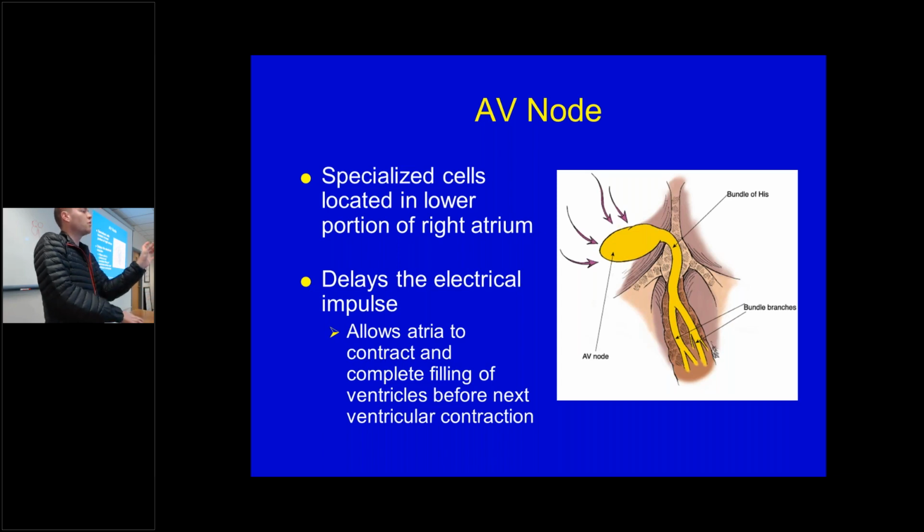So you get an impulse before there is a depolarization, right? As soon as that action potential is reached, there's an impulse. The impulse is just a straight line, and then the depolarization is the waveform. So what is the ST segment, that straight line? That's the impulse for repolarization, all right? And then the actual T wave is repolarization.